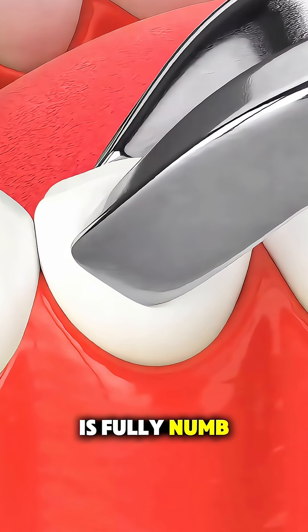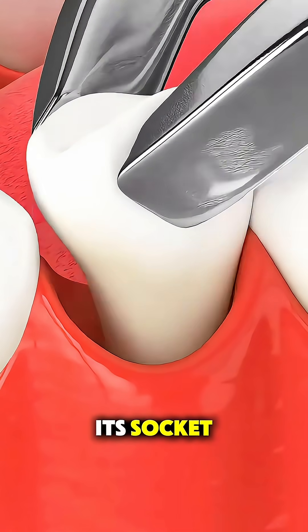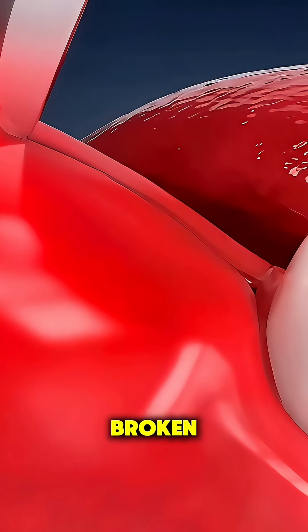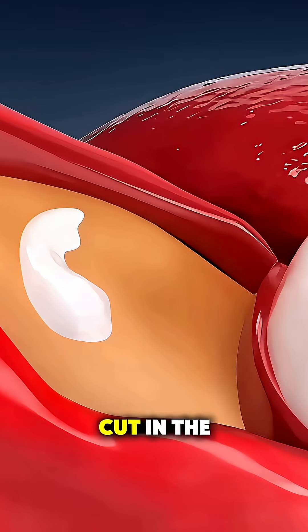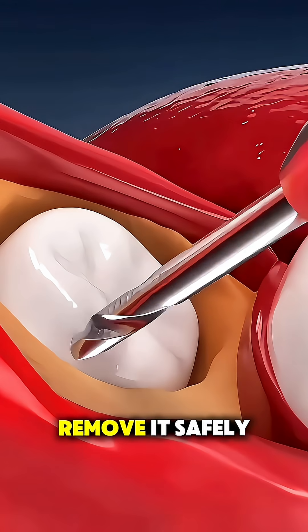Once the area is fully numb, they'll use special dental tools to gently loosen the tooth from its socket by rocking it back and forth. If the tooth is stubborn or broken, your dentist might make a small cut in the gum or even section the tooth into smaller pieces to remove it safely.